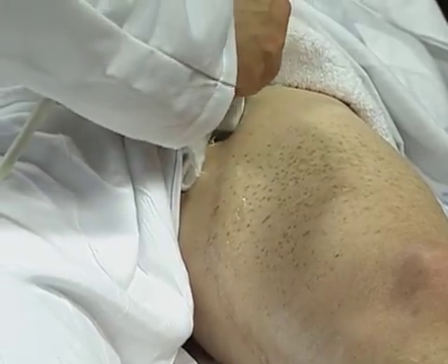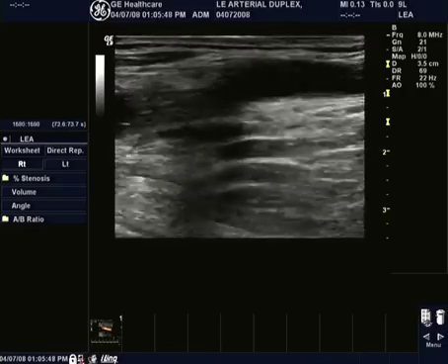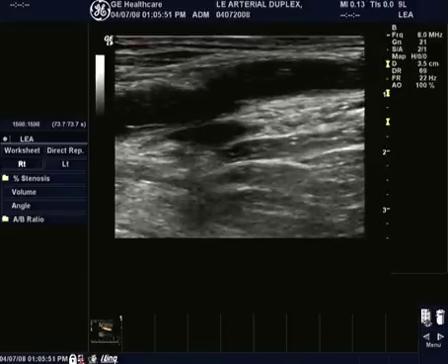Okay, so let's come back up here. And let's just take a look for a second at the grayscale. What's it telling us? Well, there's really nothing going on.